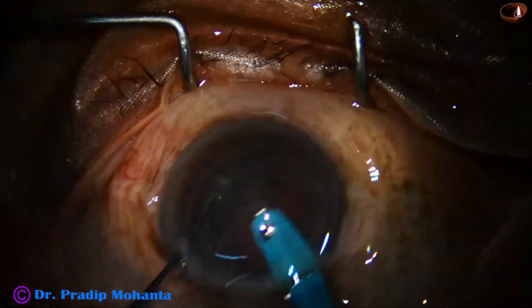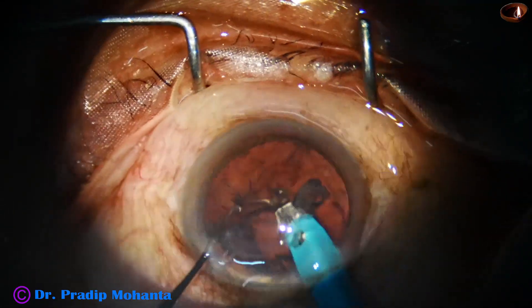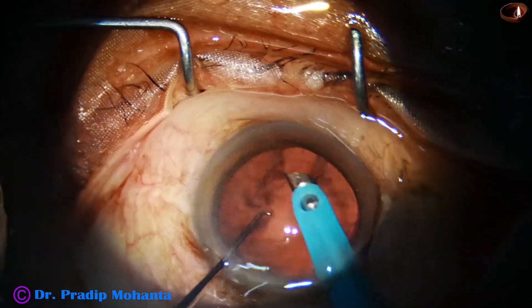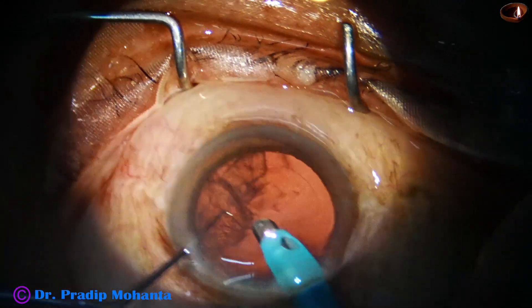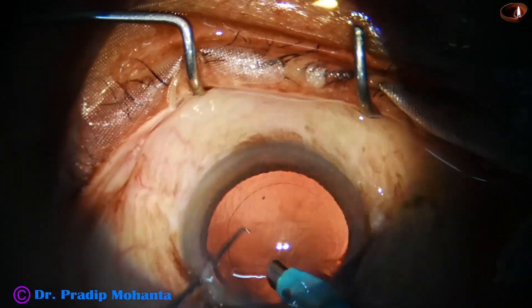And then comes the epinucleus. After removing the epinucleus, I turn the handpiece, and with low vacuum in I/A mode, I start aspirating the cortex. And in no time it is done.